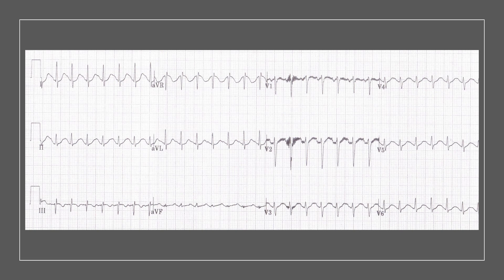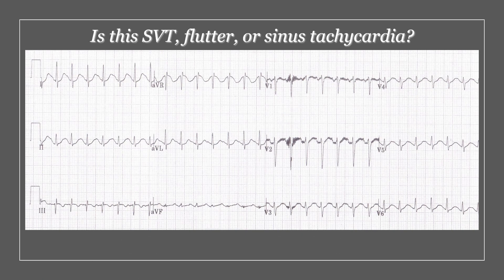Let's put this into practice. If you're faced with this ECG, what you're going to see is a narrow complex regular tachycardia. The differential diagnosis for something like this is one of three major things: first is SVT, second is atrial flutter, and third is sinus tachycardia.